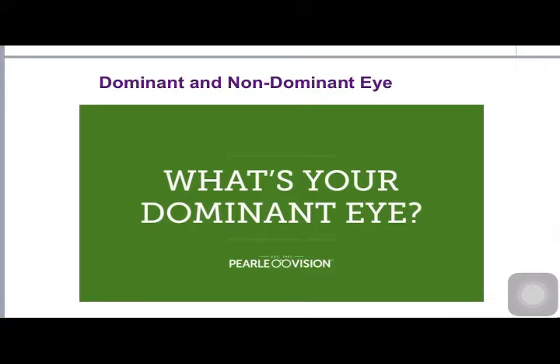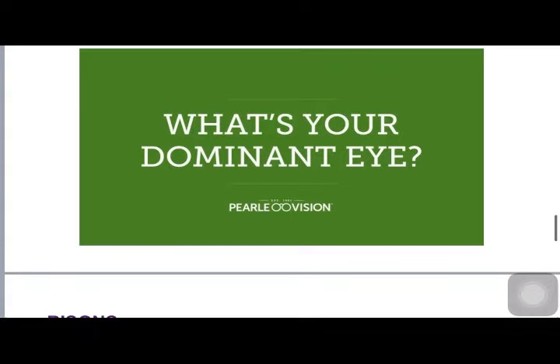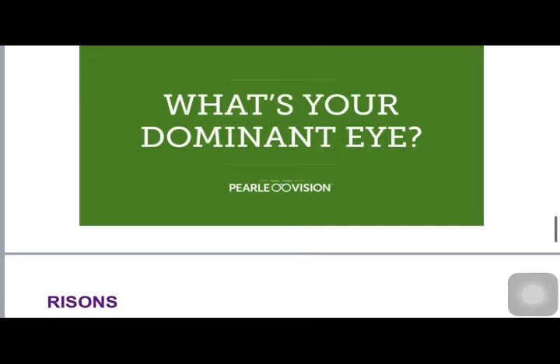Now after you find out the dominant and the non-dominant eye, then it becomes very easy, because it is just six steps after that. It is called R-I-S-O-N-S, reasons. So reasons starts with refraction. So you have to start with refracting your patient. So the first thing you're supposed to do is do a refraction.